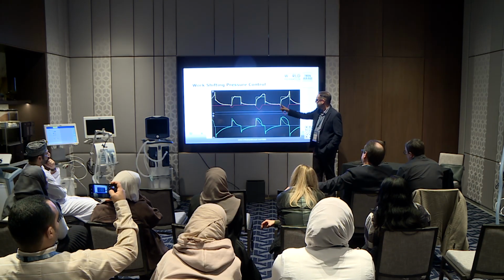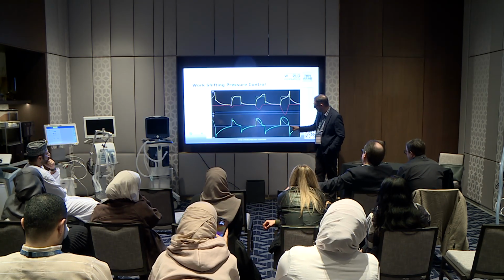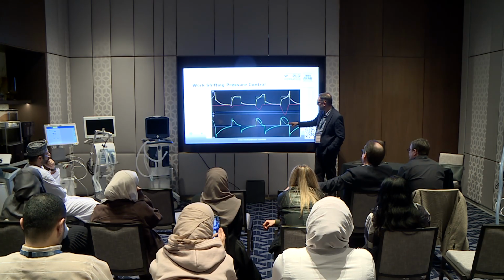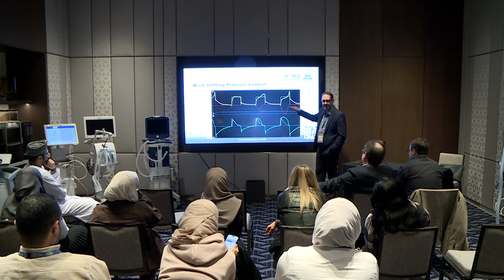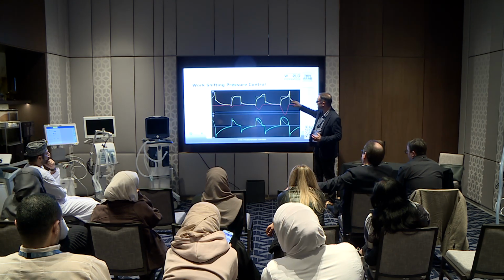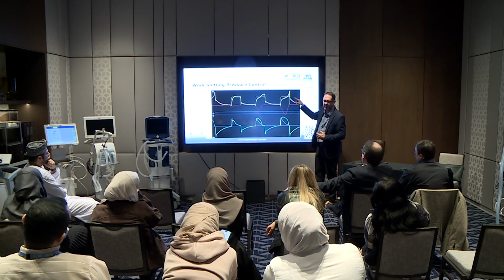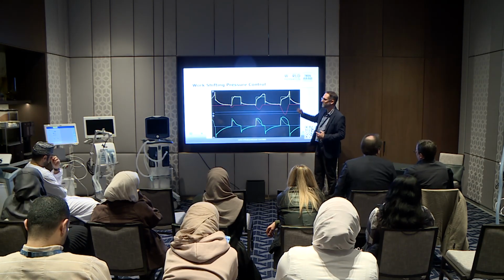Now over here, we have a very significant effort. You see that the ventilator cycles off right at the end, but there's already this huge spike because right here, before the ventilator cycles off, this huge effort is now, the passive recoil has begun, the patient's going like this, and this is reflected in the pressure. Okay, so anytime you see these spikes, it could be that the ventilator is not reaching it at all. Like if you stopped right here, it just means that it didn't reach it yet. But when you see these very abrupt spikes and almost zero flow, here it's very obvious, here it's not so obvious, but that's what that is.